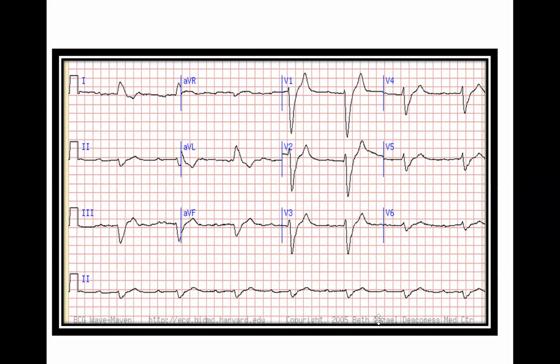Thank you. So the answer is correct. It is hyperkalemia. Why is it hyperkalemia? Sine wave and wide QRS complex. Prolonged PR interval. Short or prolonged? Prolonged PR interval. Prolonged. Okay, thank you. You can close your mic. Okay, so the answer is hyperkalemia.